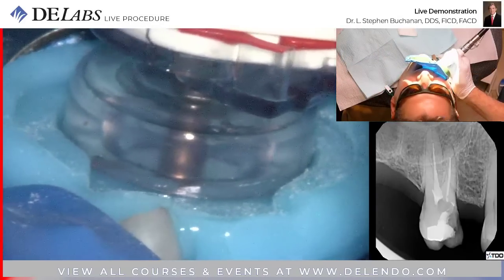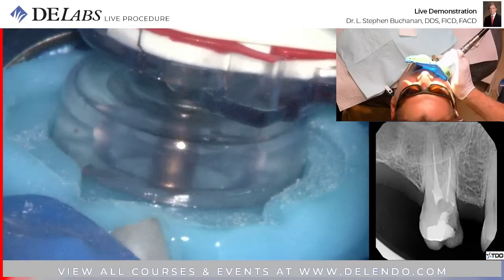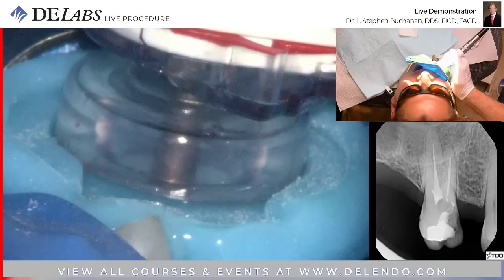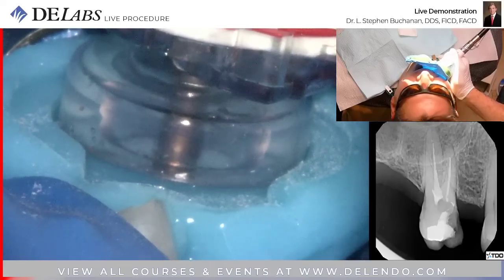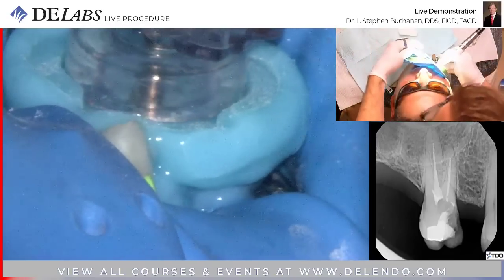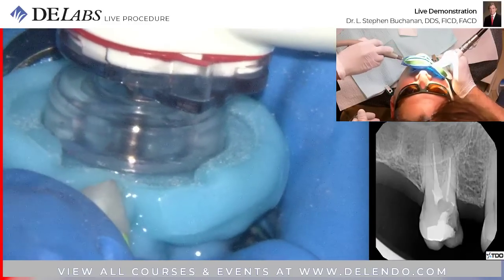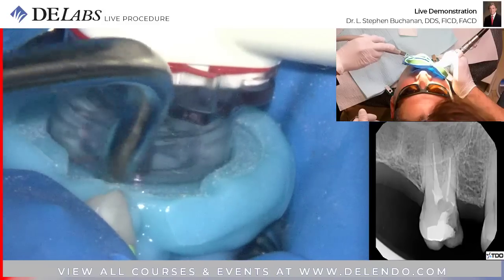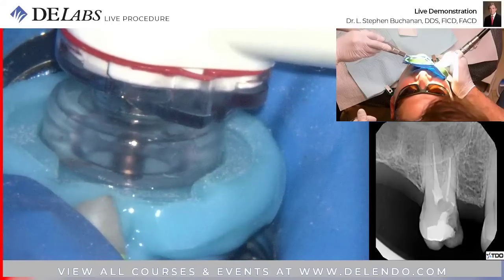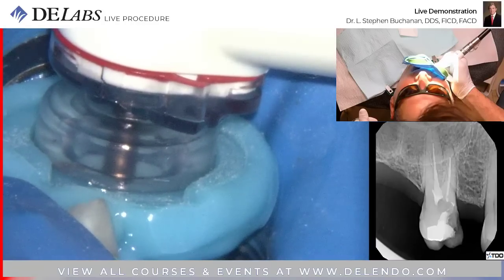We completed the seal test. It's now using hypochlorite. This is a 5-minute cycle. We're getting a little bit of water. Are you doing okay in there? Yeah. Cool. We'll get a little bit of air in there. Let's see how it's going. There we go.